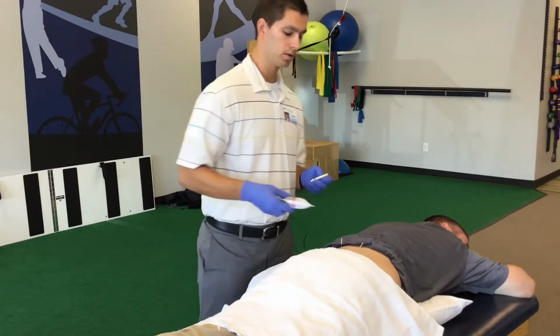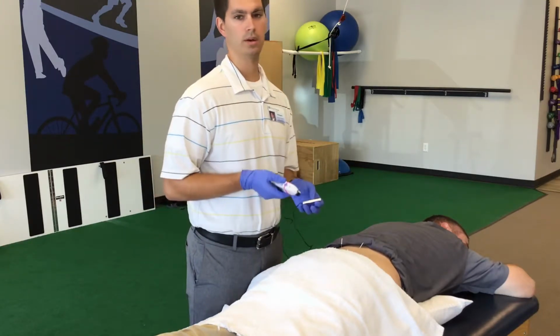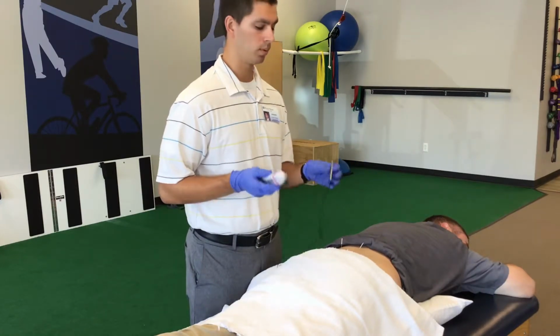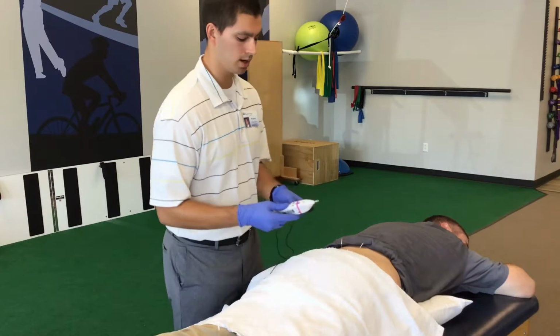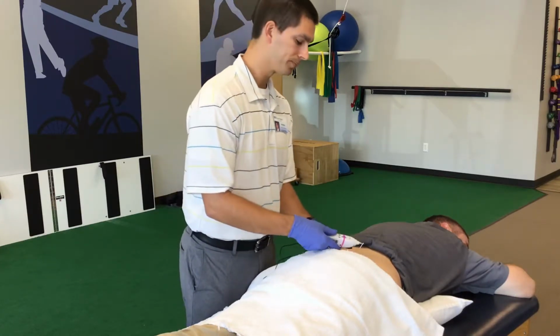And so as the needles are in here, you can just let them sit there. Some people just have an increased amount of tone, and so they do this. You just let the needle sit there for 5 to up to 10 minutes. But what we're going to do to help speed the process up is just use a pointer and a little E-stim here. What we're trying to do is generate a little bit of a muscle contraction, not something that you'll be able to see at home.